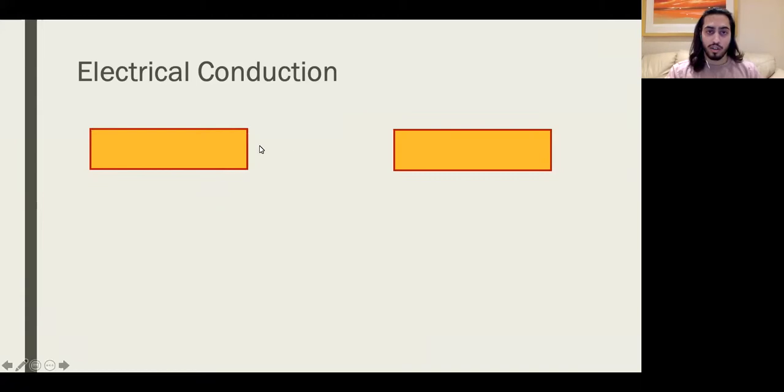So these things that are on your screen now, these are some cardiac myocytes, okay? And they have the ability to have an action potential and some electrical activity that can eventually lead to their contraction. We decide to put an electrode on one end. That's a negative electrode. That's one of the physical things that you as a doctor are putting onto the patient's skin, okay? We decide to put a positive electrode on the other end, okay? In order to formulate a lead, so a viewpoint, you need to have a negative electrode and a positive electrode.